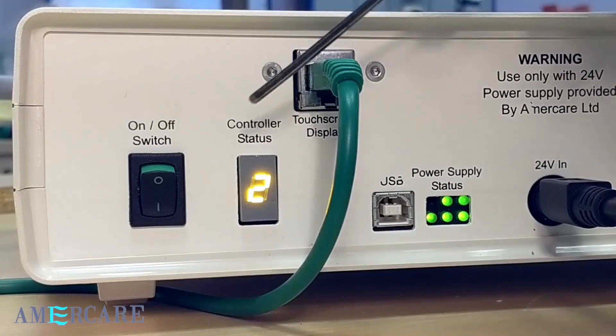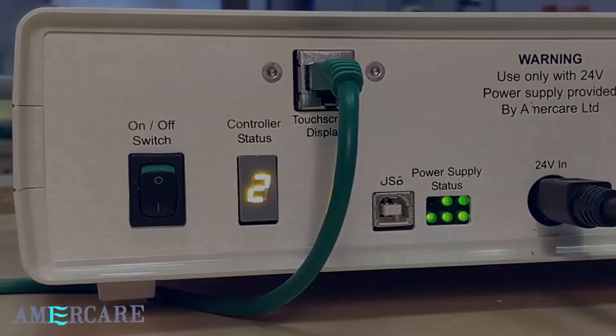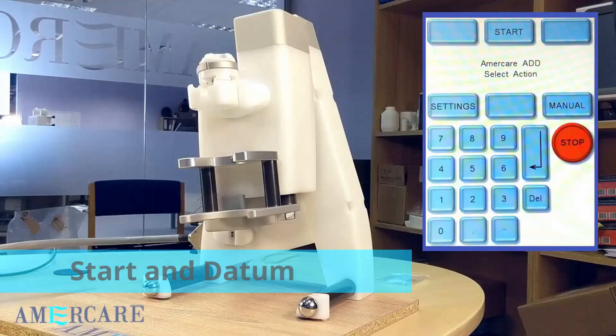The controller status will display the number 2. We can now press start on the touch screen display and the machine will datum each of its axis in turn.